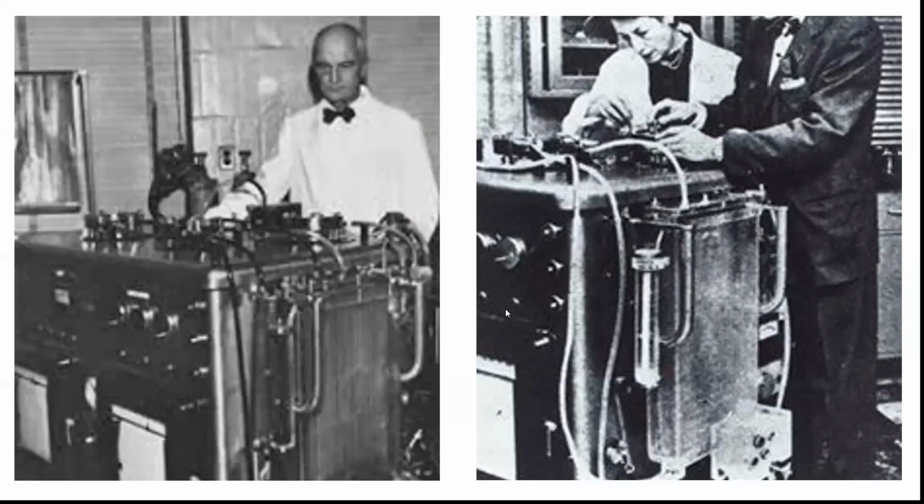So Dr. Gibbon in the 1930s developed this unit right here. And this was one of the first cardiopulmonary bypass units, which is now known as ECMO, with further advancements of this machine. From the 1930s to the 1950s, he did experiments on cats to see if this would actually work. And then in the 1950s, he actually did the first open heart repair of an atrial septal defect in an 18-year-old, borderline pediatric, adult child, which went successfully. So looking at this ECMO unit, how much did you guys guess this weighed in kilograms?